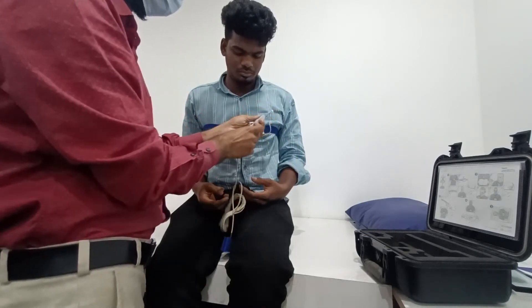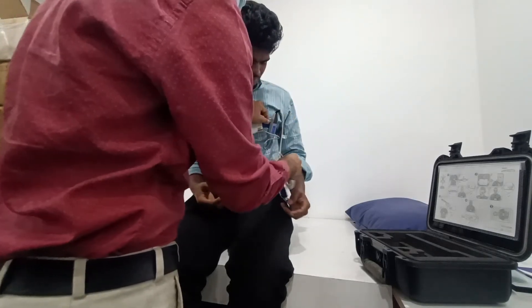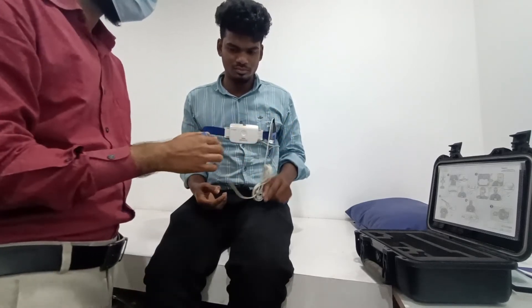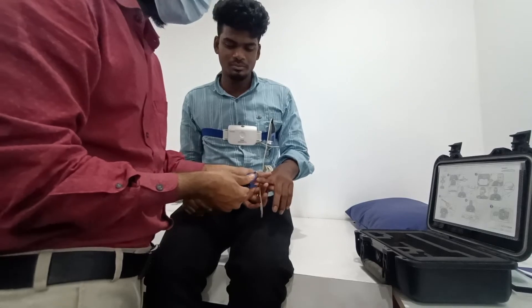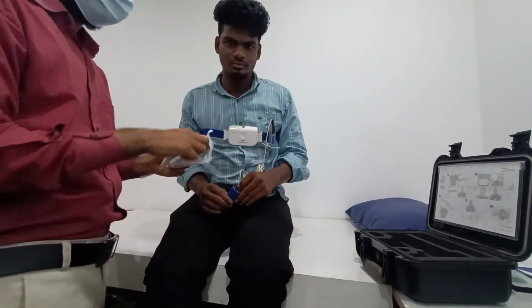Secure the oximeter on the belt, then connect the oximeter to the patient on one non-dominant finger. Which hand are you using — right or left? Right. Then put it on the left hand — any finger.